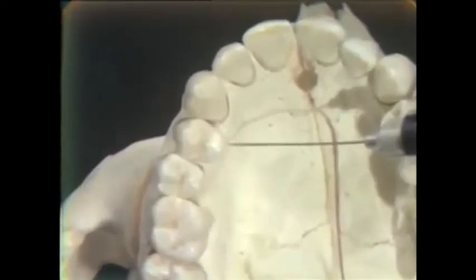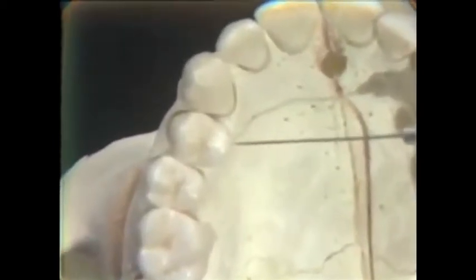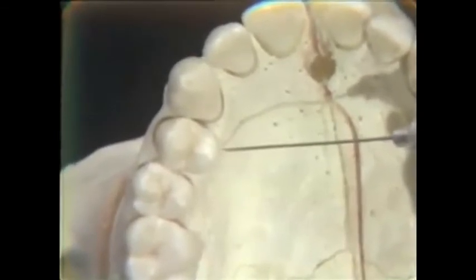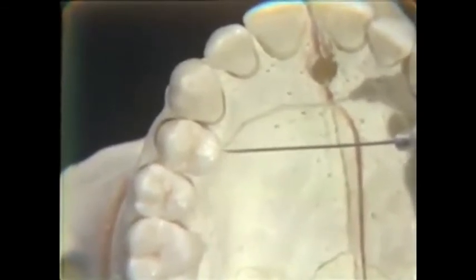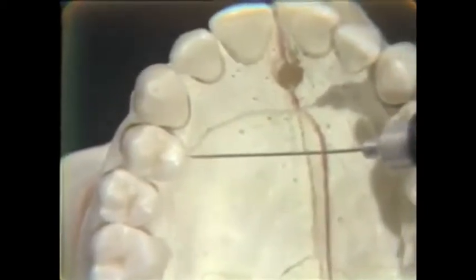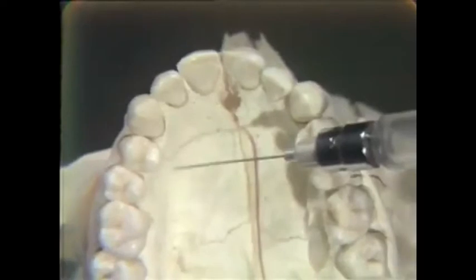And again, with a little pressure on the plunger of the syringe, and it does take a little pressure, expel a few drops out into these tissues. Needle bevel is against bone again, and as you see the tissues blanch, you will know that you've got some solution out into the tissues.